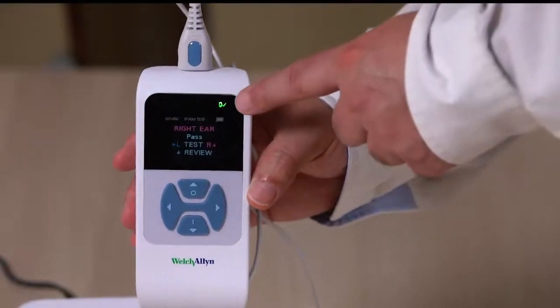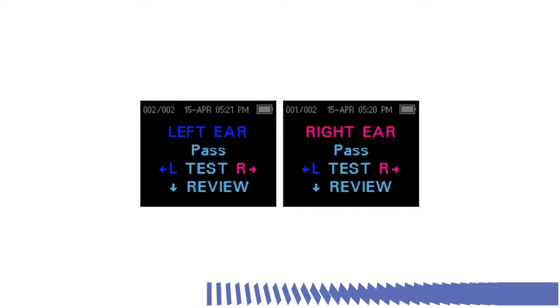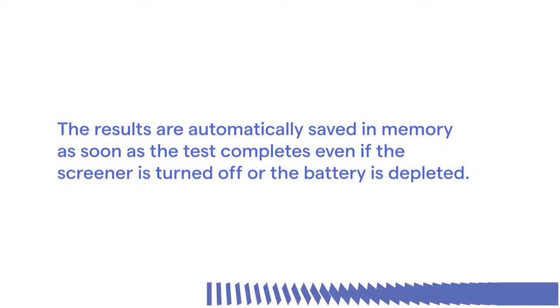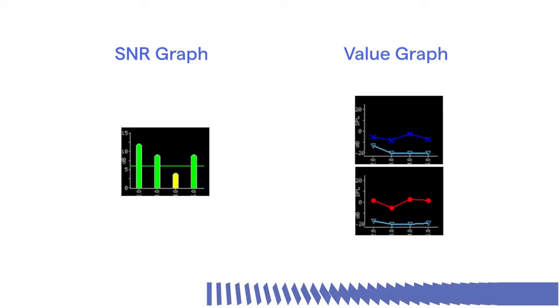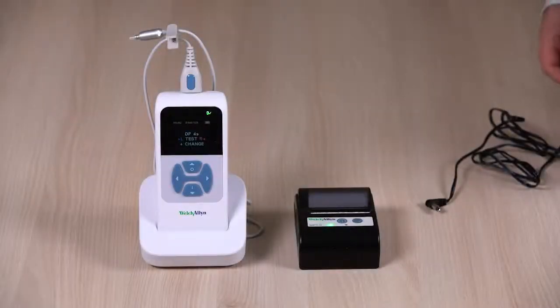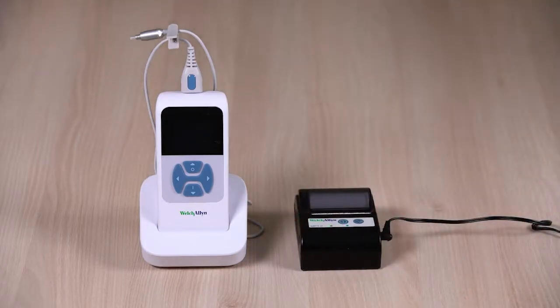When testing is complete, the green ready light is illuminated and a pass or refer result for the tested ear appears. The results screen indicates the test ear and gives the results of the test. You may also see 'noisy,' 'no seal,' or 'fit error,' which means the test was not completed. The results are automatically saved in memory as soon as the test completes, even if the screener is turned off or the battery is depleted. The detailed test results are displayed as a graph — the default view is a signal-to-noise ratio, or SNR, bar graph, and you can also choose to view the results as a value graph. Utilize the data manager software to save and review test results. The optional thermal MPT2 printer allows you to print results directly, or you may also print from the data manager software using your PC.